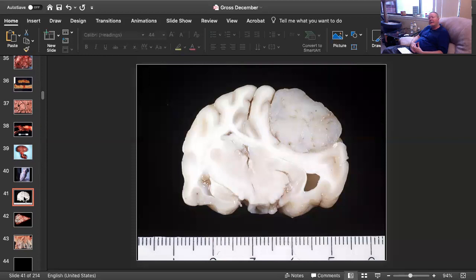Slide number 8 is tissue from a cat. Can you give me 3 morphologic diagnoses? Okay, so one's a primary morphologic diagnosis. The other 2 are secondary to this. But the one that I would like is there is a large neoplasm, which is on the surface of the cerebrum.